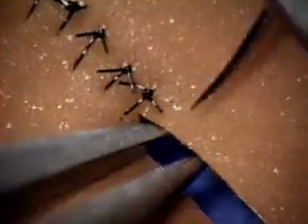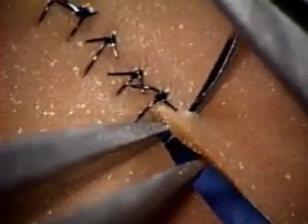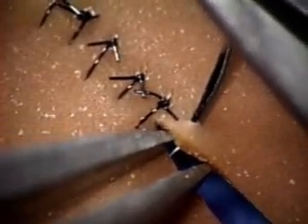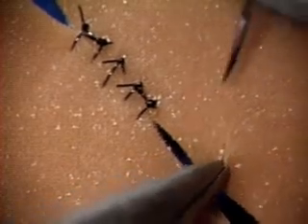In delicate vessel tissue, that kind of struggle can enlarge the needle hole, and that's bad news. I need to mention some do's and don'ts concerning the way you handle the tissue with your left-hand forceps. Using the left-hand forceps as a counterpressor is a nice atraumatic method, which I strongly recommend. Two other methods are useful in vessel surgery: picking up the adjoining stitch and picking up the outer layer of the tissue.